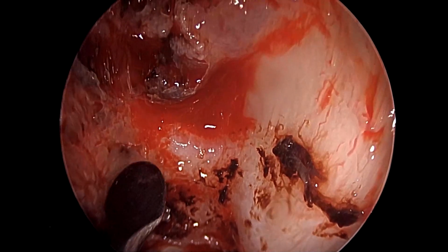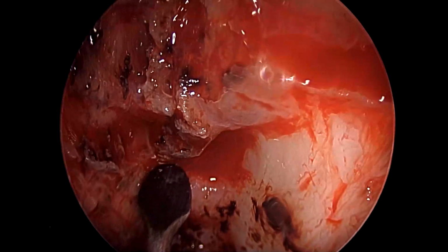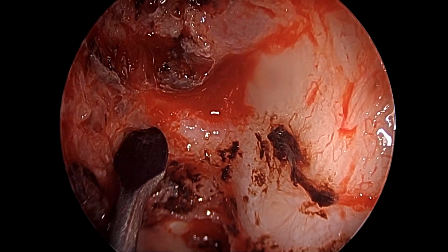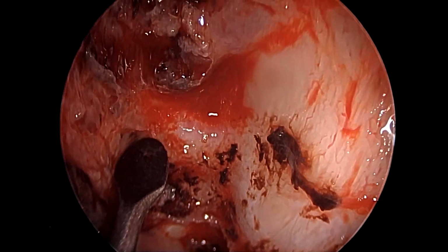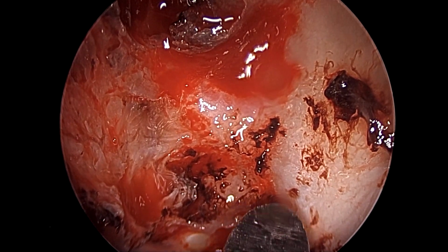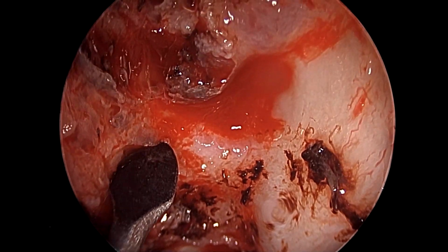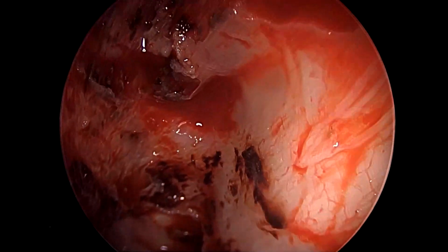So now we're using a double-angled elevator to point to the exact site of defect in the fovea ethmoidalis, as well as to slightly enlarge it, because as I mentioned, very small defects are nearly impossible to repair. So we definitely have to remove some more bone in the defect area to enlarge it, as well as this gives us the opportunity to create space between the bone and the dura for eventual placing of our graft material.